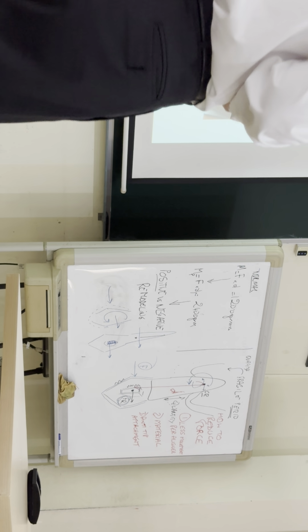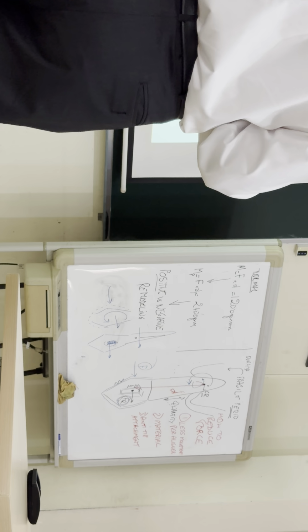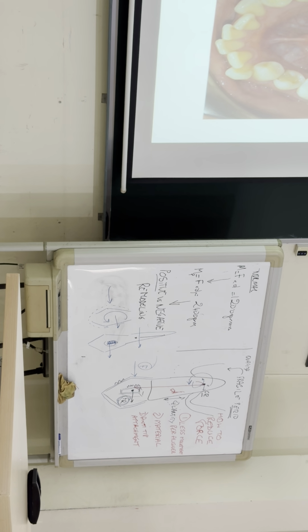Implant. Implant, and don't forget the inter-premolar distance is very small, so I'm going to have to expand that and close the perio here. These cases look like, okay, let's do it. Be careful, because you cannot move this tooth. It's going to be hard to put an attachment here, and she has a lot of crowding, so maybe start looking at extraction. If you do non-extraction on her, it's going to be a tough one. So be careful with this patient.